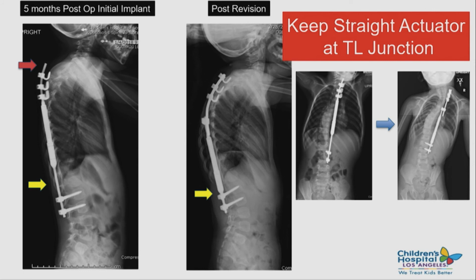I think as you produce distraction, though, I'm not so sure that you're distracting from above and below, and so it's not just the upper portion you have to think about. So I'm not sure you can say, oh, the lower half is fine. I don't want to go that far. So if you're distracting on the spine or the ribs, it would probably have the same effect in the middle of the spine, right? Maybe. I mean, we just don't know. Yeah, just don't know. Fair.